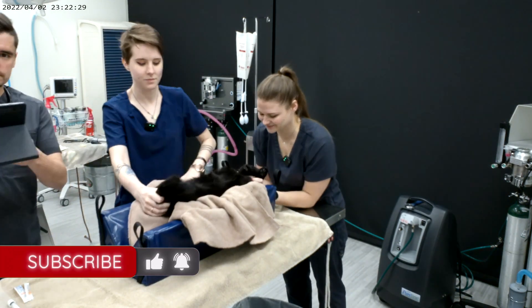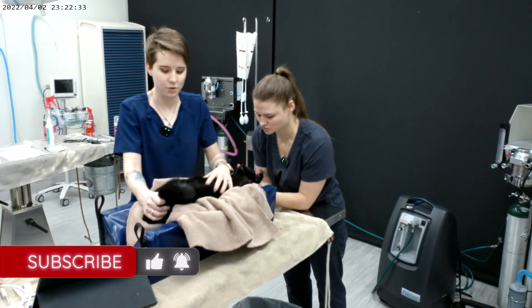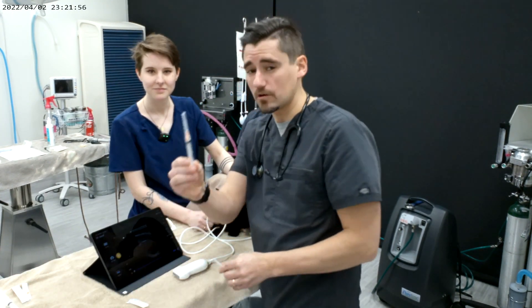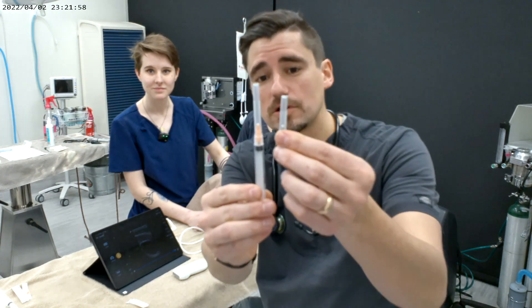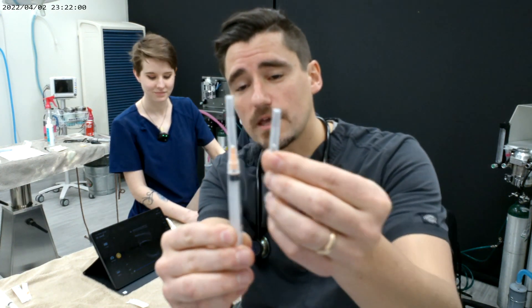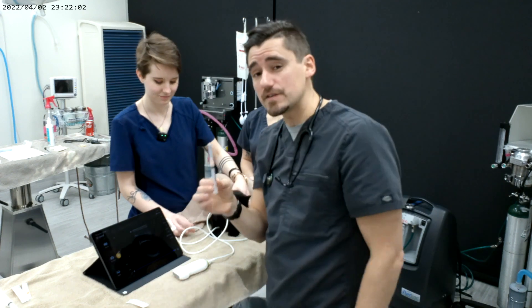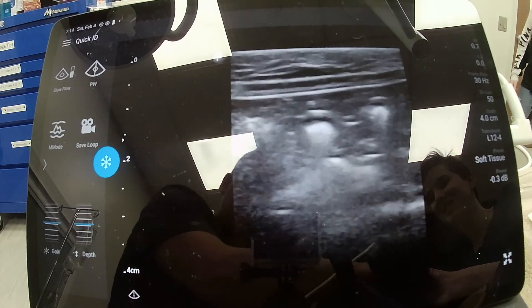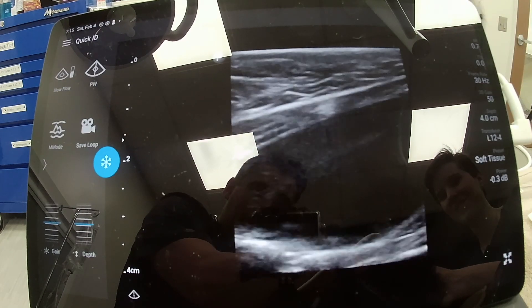So what we're gonna do today is have the cat on its back and use a long, very small gauge needle to get some urine. This is called a cystocentesis — meaning I'm going to use a needle, guided by ultrasound, to insert it into the bladder and pull some urine.